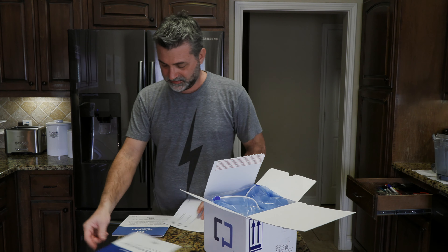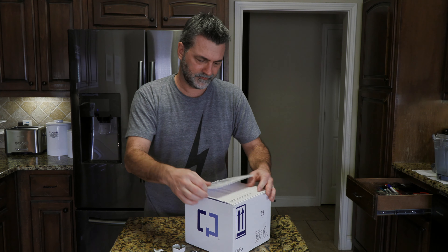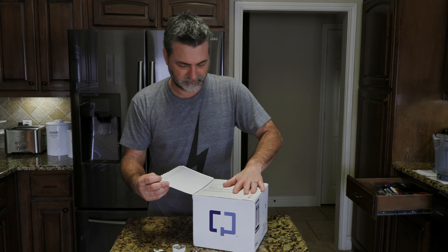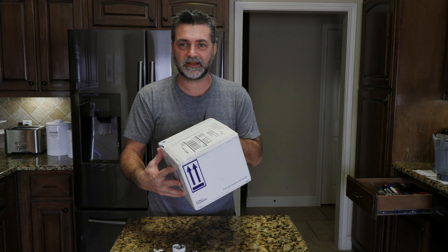And that was not as easy as you would think it would be, but I did it. Then you peel this off, pull that up, and there is the return label underneath. Close it up, pull this sticky thing off, close it up, and I think we're good to go. This goes to UPS — UPS next day.